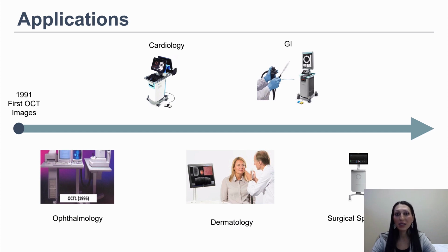Developed at MIT, its first commercial application was in ophthalmology in 1996. Today, there are over 30 million eye exams performed annually using OCT. OCT was then adapted into cardiology to examine the coronary arteries in vivo, and there were other applications as well in dermatology and upper GI imaging. Today, we have an OCT device aimed at imaging excised surgical specimens in order to visualize the margins in real time at point of care.